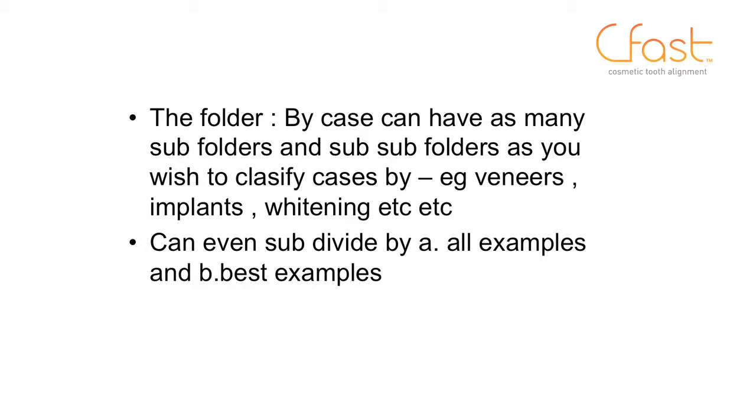And that's really so that when we're discussing with our patients, we don't always have to remember the exact names. We can have case examples. But because we can copy a shortcut from by patient, we're not duplicating the amount of drive space that we need. We're just copying a shortcut to the patient. So when you finish a good case, remember just to create a shortcut and put it into your library of case examples. Either that or have a very good memory to remember all those patients' names.